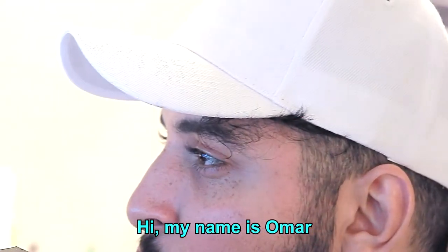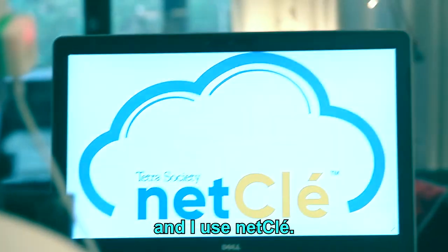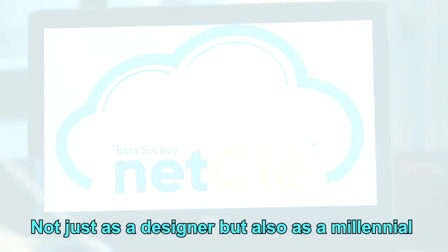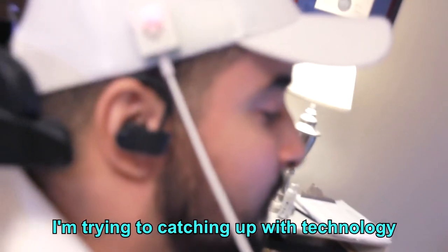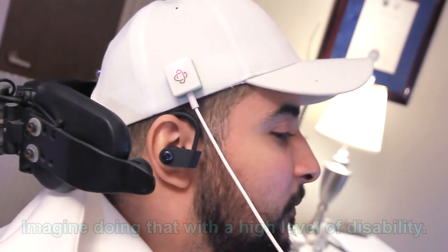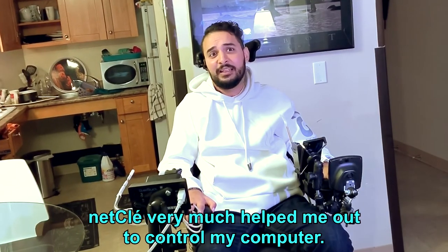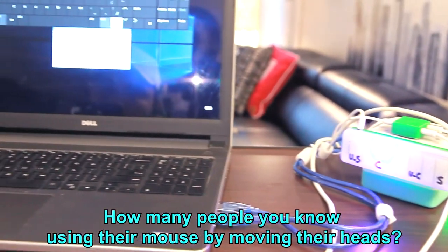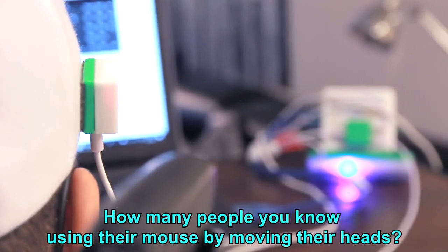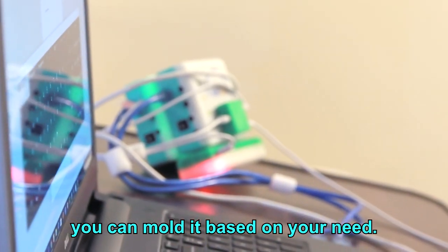Hi, my name is Omar. I'm a graphic designer, graduate from BCIT, and I use netClé. Not just as a designer, but also as a millennial, I'm trying to catch up with technology. Imagine doing that with a high level of disability. netClé pretty much helped me out to control my computer. How many people do you know using their mouse by moving their head?